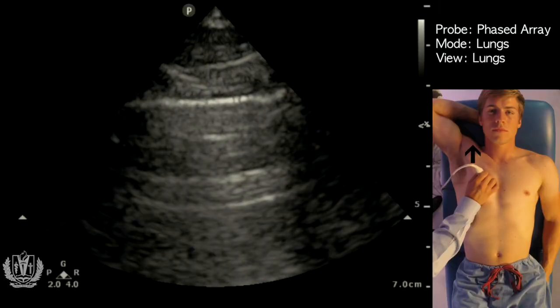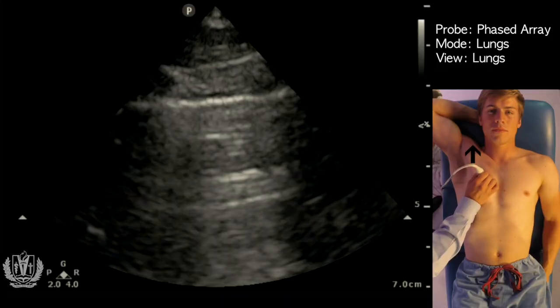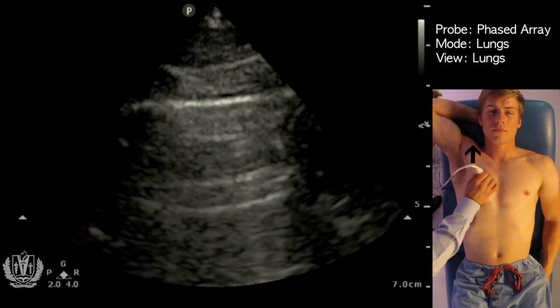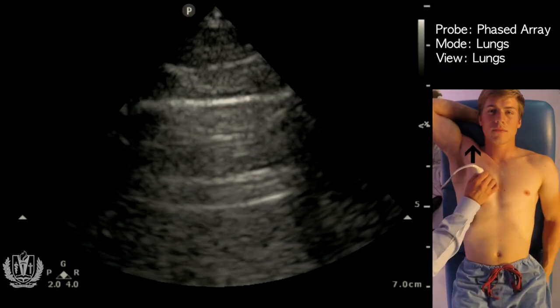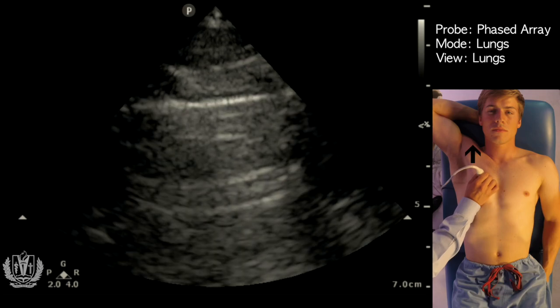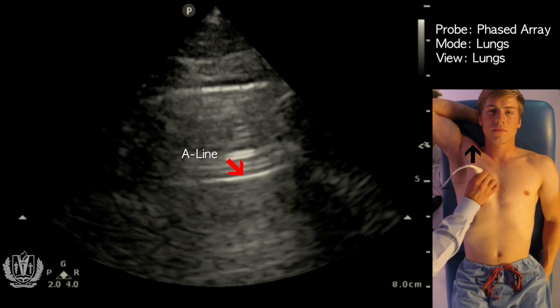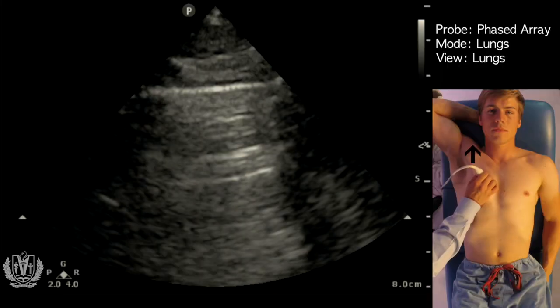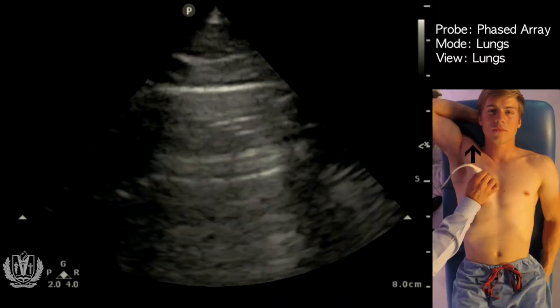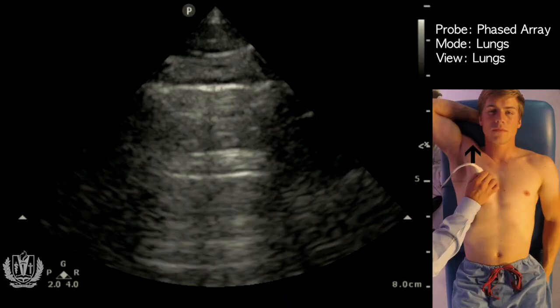After adjusting the gain, this is a normal thoracic scan with normal lung sliding, indicative of no pneumothorax. Another thing you can look for on this view is what's called A-lines — those are basically reverberation artifacts coming down. Other things you can look for are called B-lines, though this patient does not have any. B-lines are indicative of interstitial edema or pulmonary edema.